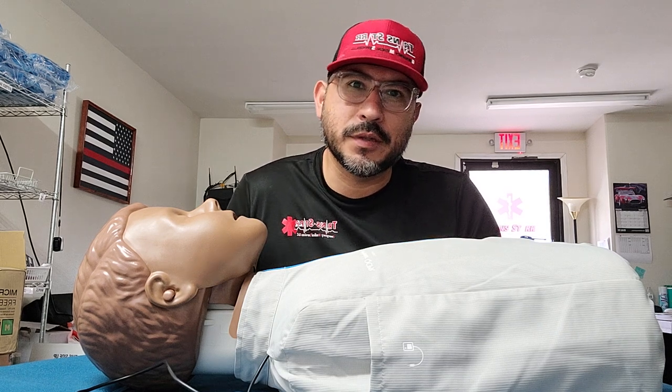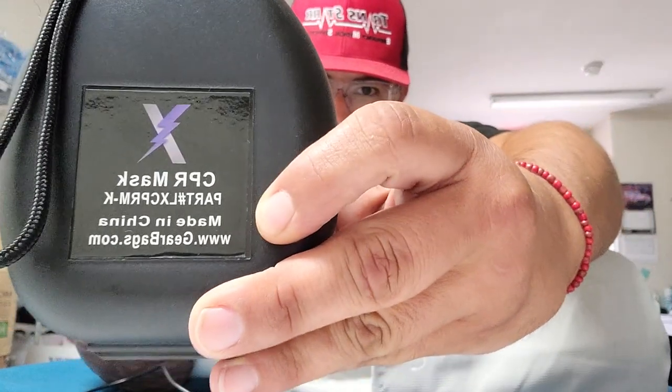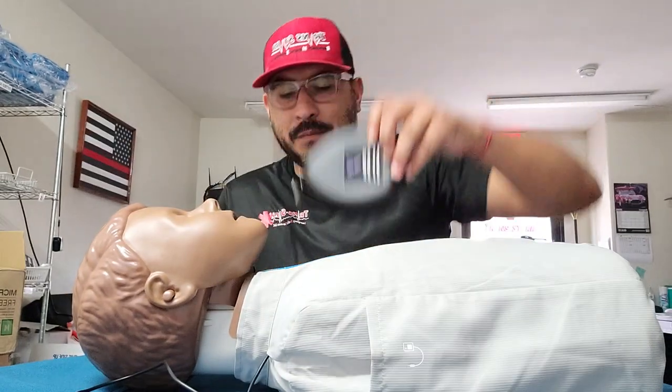Remember, you want to keep safe whenever you're going to help someone, because if you're not safe, how can you help others? So to begin with, this is just a simple CPR mask that I bought on Amazon. It wasn't more than 10 bucks.